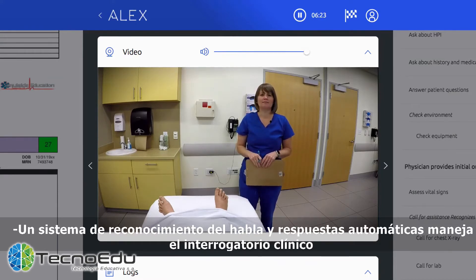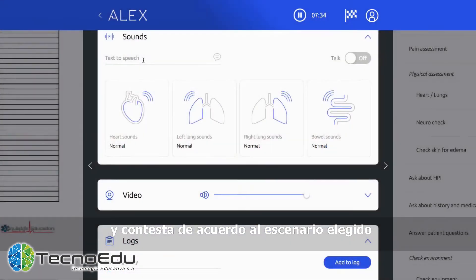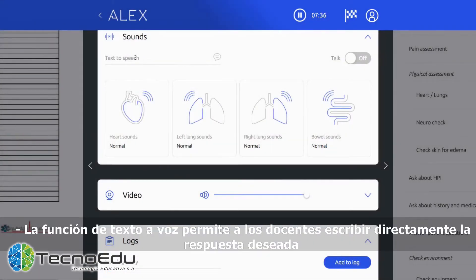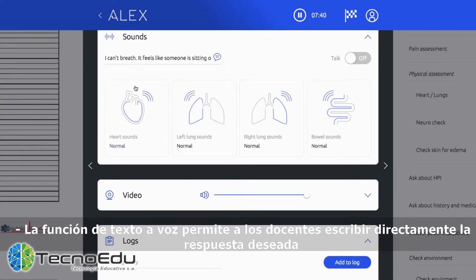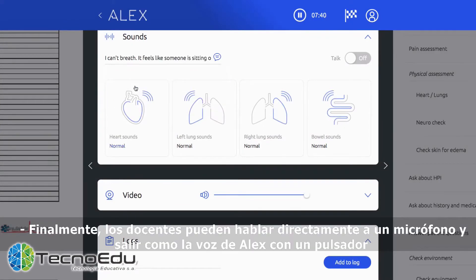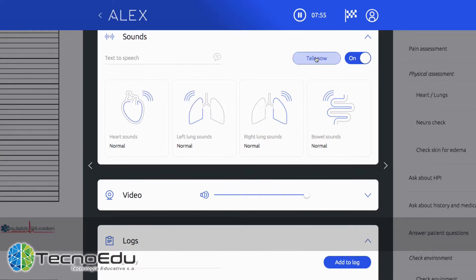Alex employs three distinctly unique options for communication. His speech recognition and response system listens for clinical interview questions and responds according to the selected scenario. His text-to-speech functionality allows users to simply type the desired verbal response, and finally, you can deliver your own voice through Alex with push-to-talk.